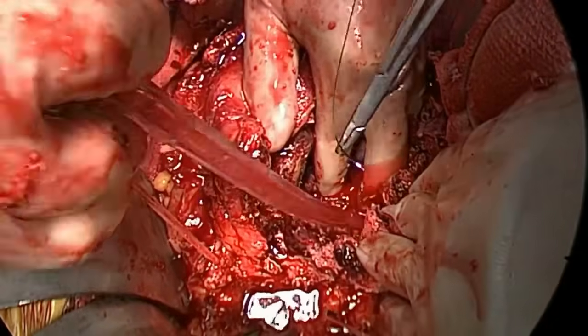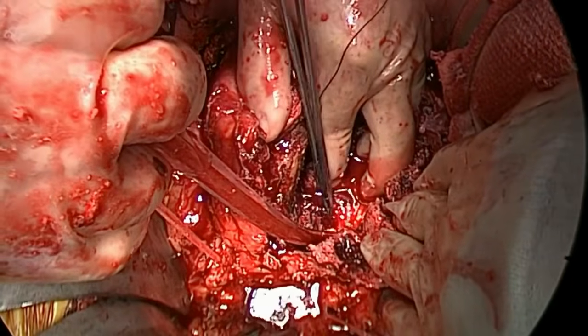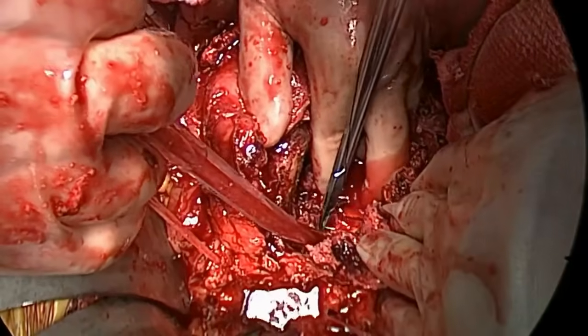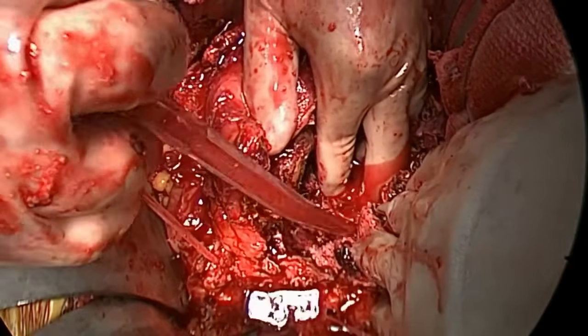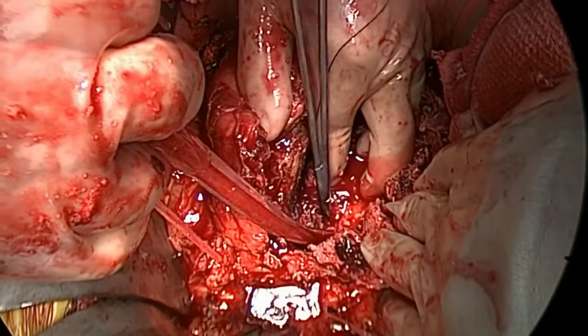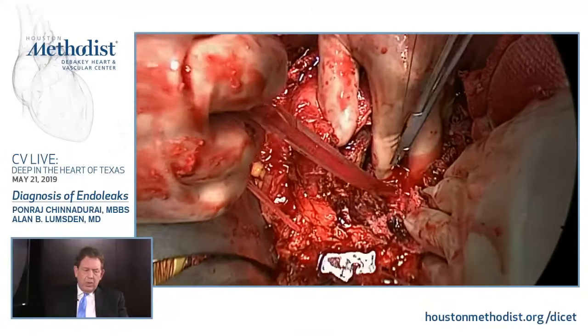And this is from a case that I did. You can actually see the endograft is under my hand, and that blood that's squirting when we've opened up the endograft, you can see that some pretty good pressure comes in, and this is just one lumbar artery. Sometimes there are several of these. That alone can be enough to cause the aneurysm sac to enlarge. And if it doesn't, it certainly can be picked up on a CT scan, and it drives ever more imaging.